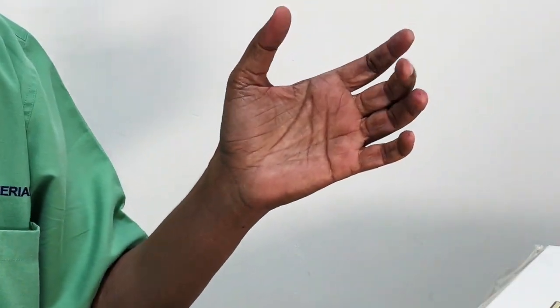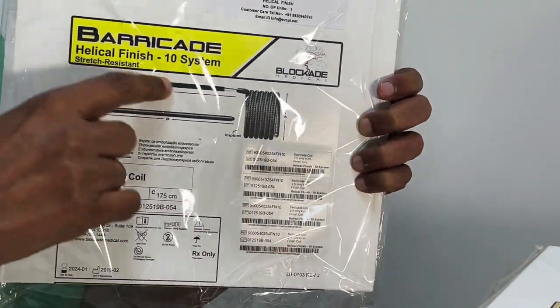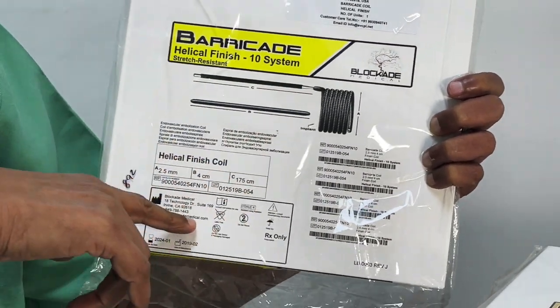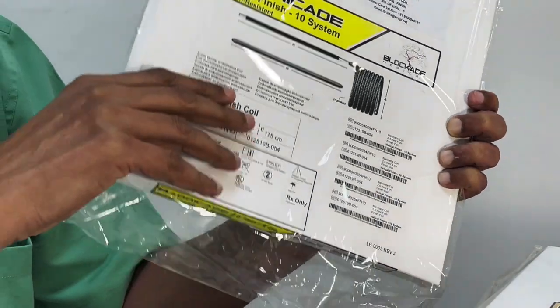Here is another one. This is called helical finish. So fill and finish, all of them are very soft coils. This is like the last coil you're trying to push in. And again, what's the diameter, what's the size, is all simple here for you. Everything will be measured as 2.5 into 4, right?